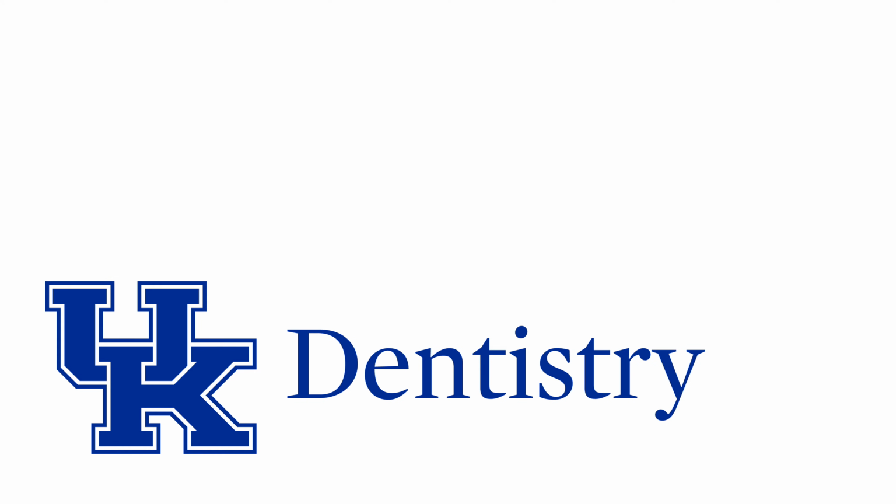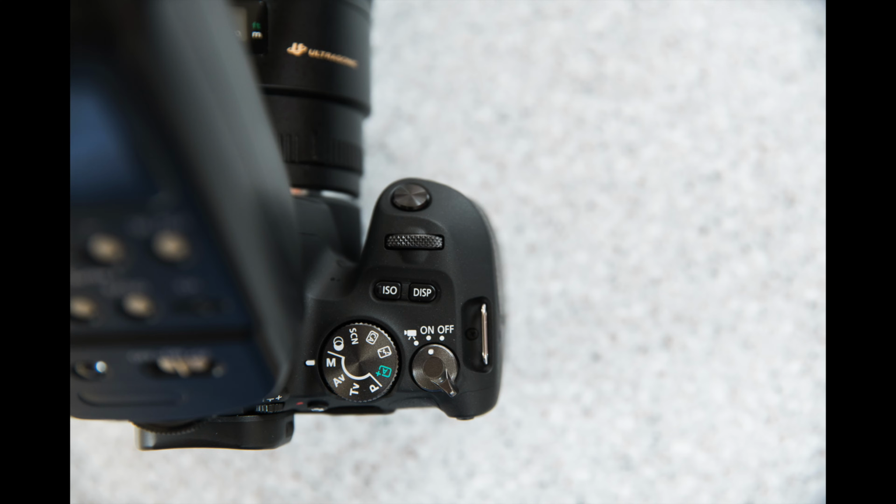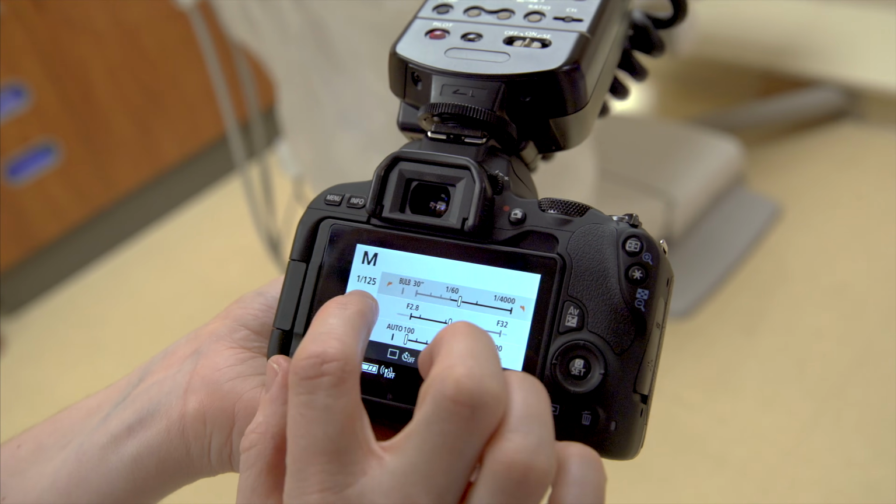There are several camera options. For this video, I am using a Canon Rebel SL2 with a 100mm macro lens and a macro ring light. To begin, have your patient stand behind a plain, preferably white background, about 3 feet from the wall.